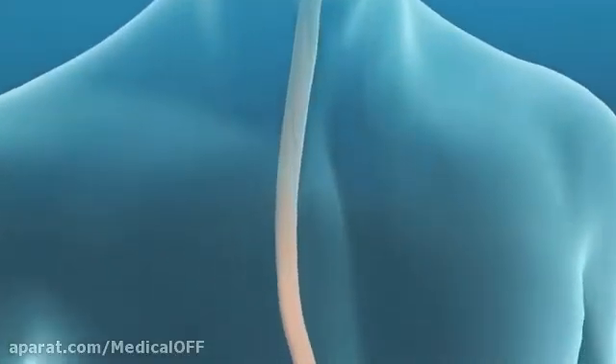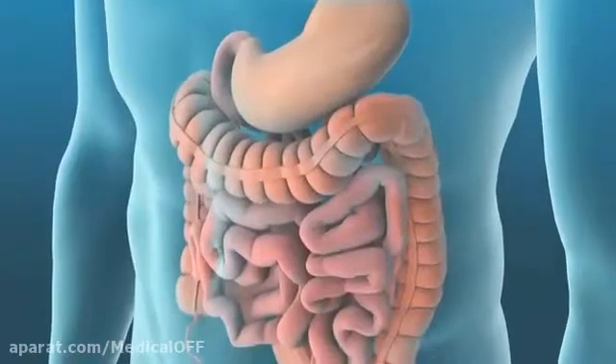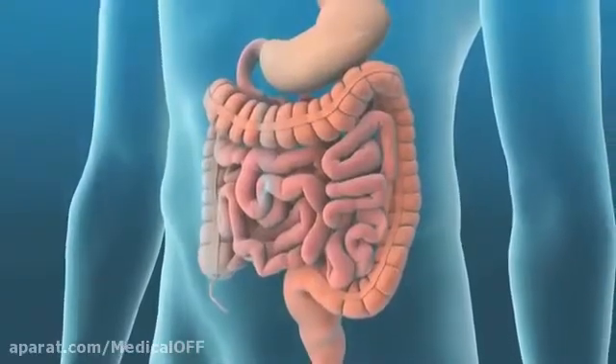Whether you are 50 years old and due for routine colorectal cancer screening, have a family history of colorectal cancer, or have abdominal pain or blood in the stool, your doctor may perform a colonoscopy to examine the inside of your large intestine or colon.